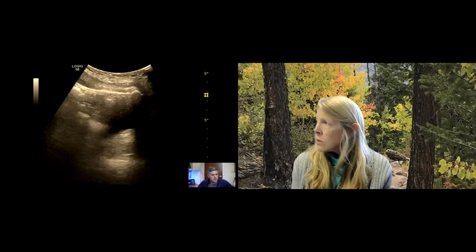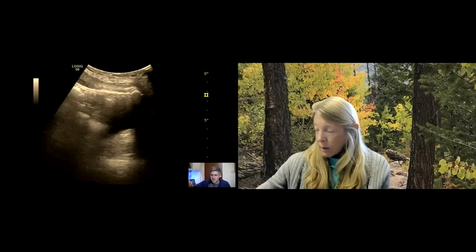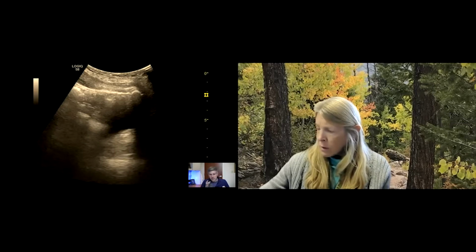And that is going to be the bladder, right? So you find that pubic symphysis, you put your probe on the pubic symphysis and look right above that, and your bladder will sit right there. And it's really a helpful way to understand the anatomy, and to really identify where you're at, and to not fall prey to some of the pitfalls that we'll talk about later, right?